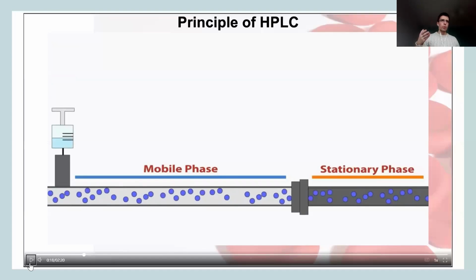When we reach the point that we're going to inject the sample, we're not injecting pure hemoglobin or an extract of hemoglobin. We're injecting into the analyzer, automatically or manually, whole blood. So obviously we're talking about hundreds of molecules, and we are just interested in one molecule, which is inside the red cell. So we need to get access to it. When the sample is injected, various things are going to happen to the sample itself, but essentially we are just going to focus on and target the hemoglobin. Everything else inside the whole blood is just going to be discarded.